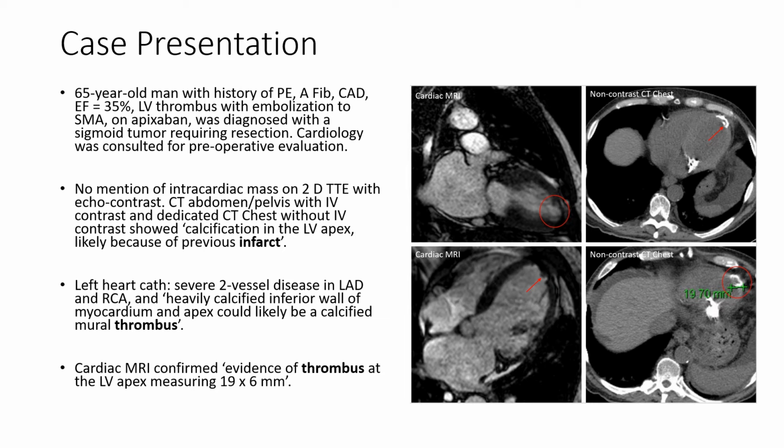A dedicated CT chest without intravenous contrast was also completed and read by a different radiologist and also mentioned calcification in the left ventricular apex, likely because of a previous infarct.